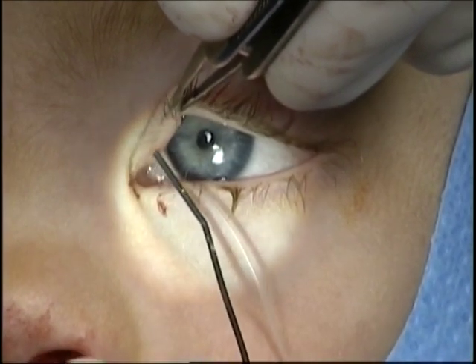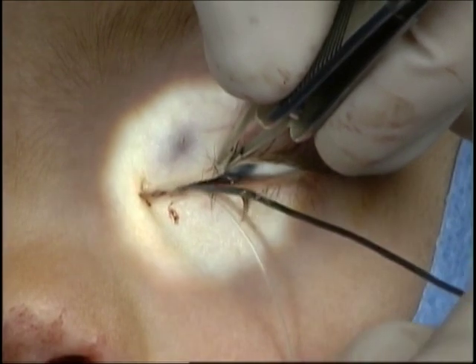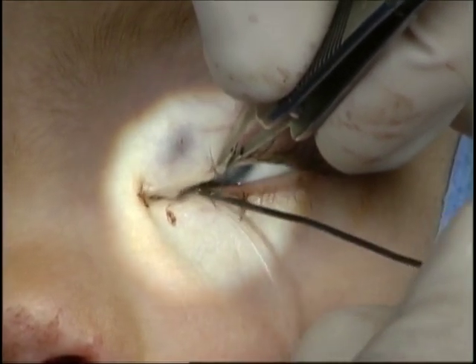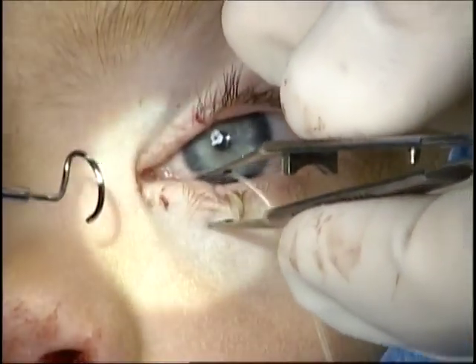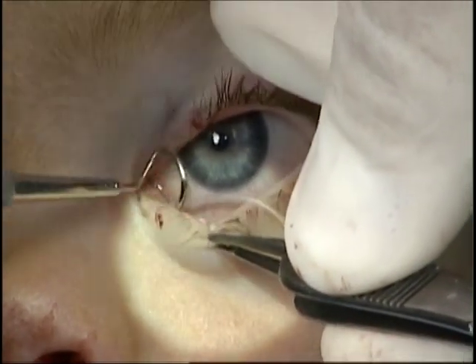Options to address this include canalicular cut down or the procedure demonstrated in this video. Previously, the stent was able to be successfully placed through the lower canaliculus, nasolacrimal duct, and retrieved from the nose.